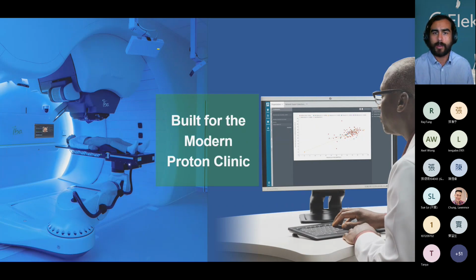We took a brief break from the market as Exio became end of life, but now we've managed to put all of the proton therapy functionality for the modern clinic within Monaco. And I say that it's built for the modern proton therapy clinic because during development we collaborated with a lot of industry partners, such as IBA, as well as with a lot of leading clinicians who are treating proton therapy patients every single day.